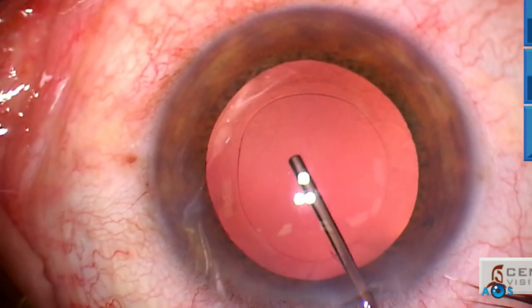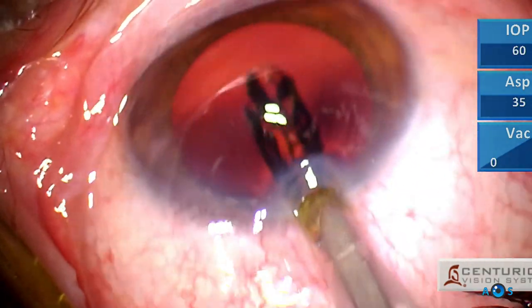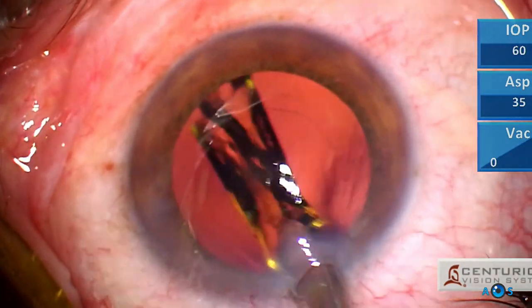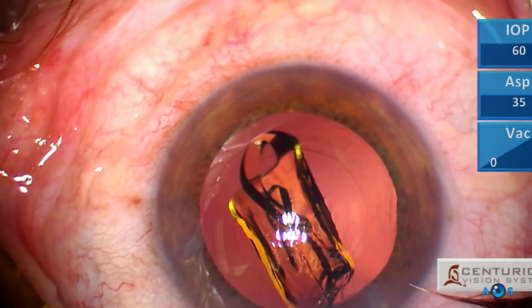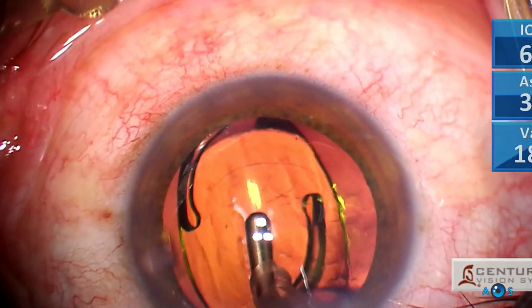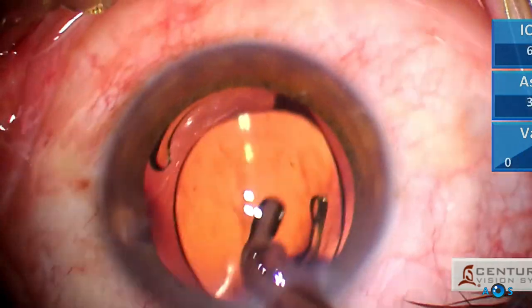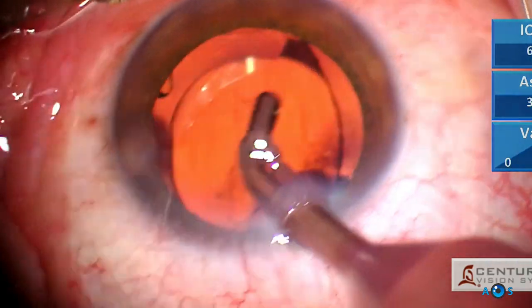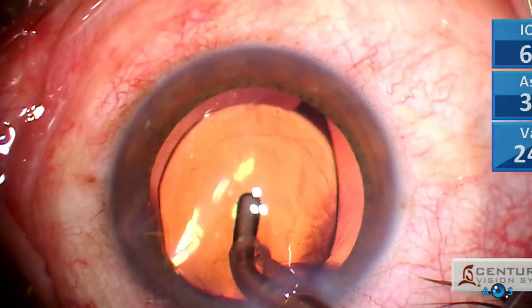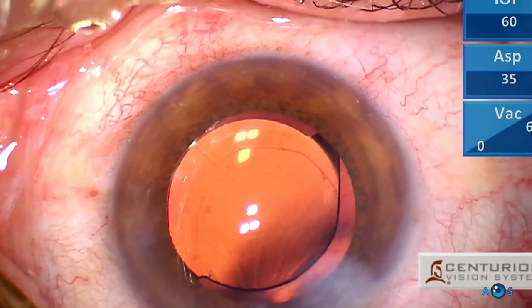The Clareon Panoptix IOL will now be implanted using the new Monarch 4 injector for Clareon lenses. The lens quickly unfolds in the capsular bag. Now it is just a matter of thoroughly removing the OVD and centering the main diffractive ring of the Panoptix with the corneal light reflex. The case is now complete.